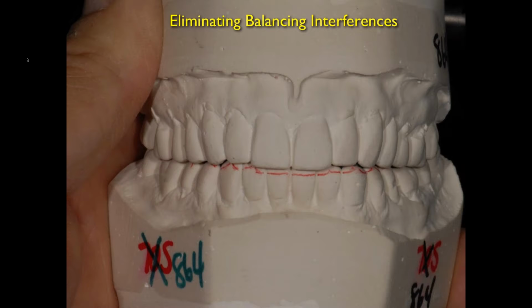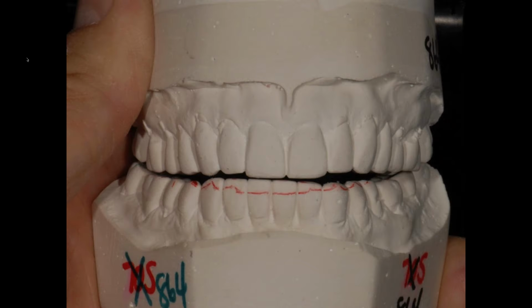But here's a case here where we went into a lateral movement, okay? And all of a sudden, lo and behold, all the teeth are not touching in lateral, which means we moved the mandible to the right here in this case, which means that something else is lifting off those teeth. What is it? The first place you look is in the back, and you can also see that our cuspid isn't even touching.